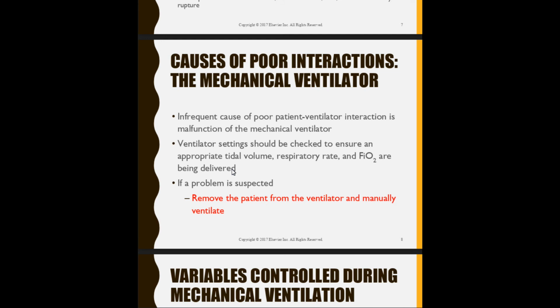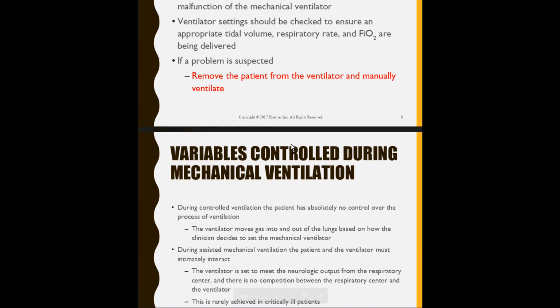You have a big old balloon slug there, and with that balloon slug, that's going to cause a decrease in tidal volume. So you might have a low minute ventilation or low volume alarm appear, and then when you look at the patient, you'll see that the Ballard balloon is all inflated, and that's where your volume's going. Don't be afraid to disconnect and bag. Okay, and bagging, when you're in control of that, most likely is going to help the patient drastically. Especially in an emergency setting, don't be afraid to disconnect them and bag them.